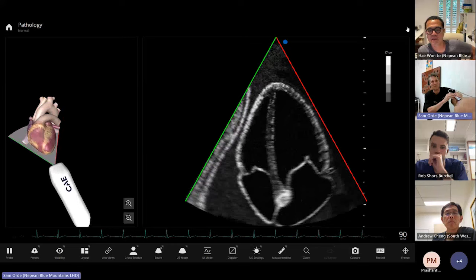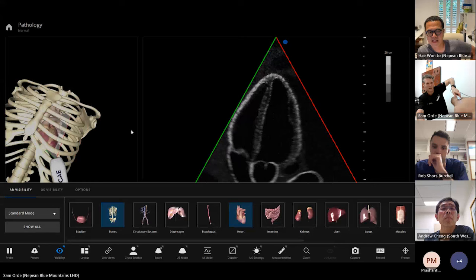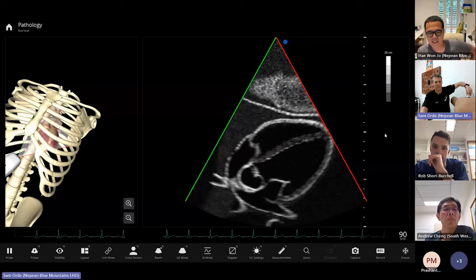Someone asks whether the same rotation can be demonstrated from the subcostal view. Trying it: moving the hand around from the subcostal four-chamber — it's sort of exactly the same relationship. That's actually something I've never done before — nice to see.